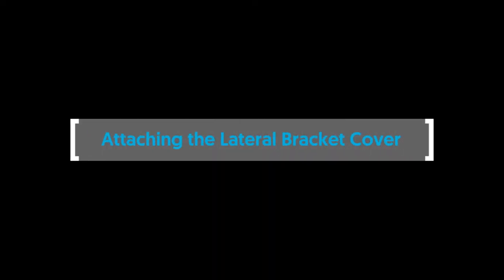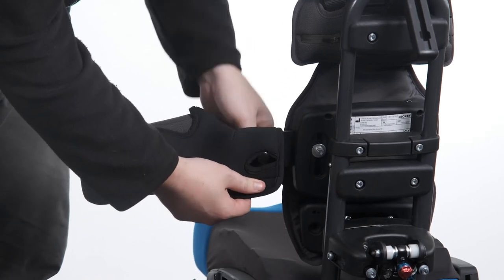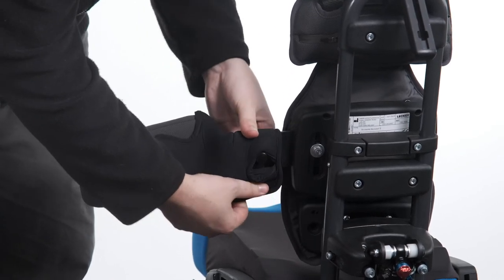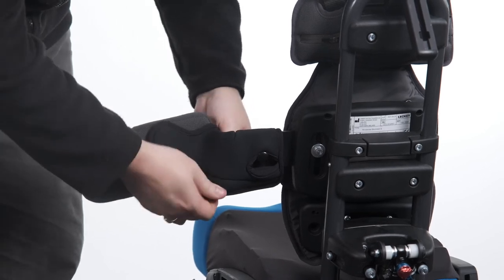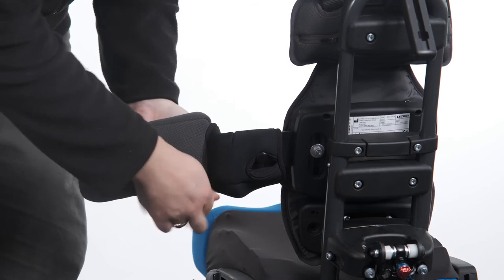Attaching the lateral bracket cover. To attach the lateral bracket cover, undo the velcro and wrap the cover over the platework. Secure in place with the velcro and insert the extension tab into the lateral cover.